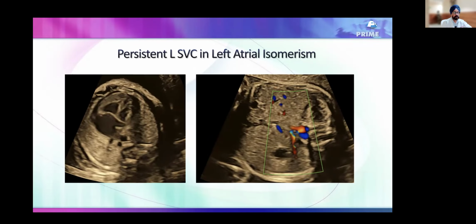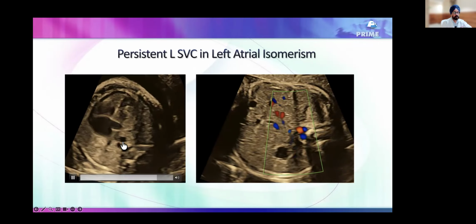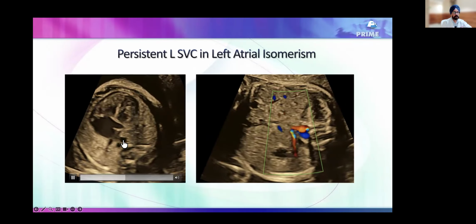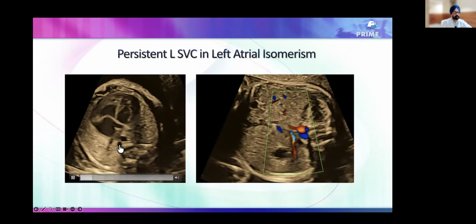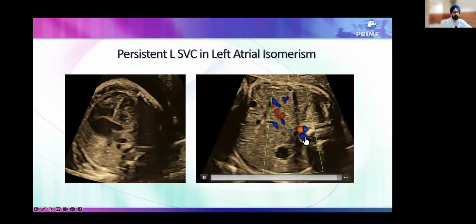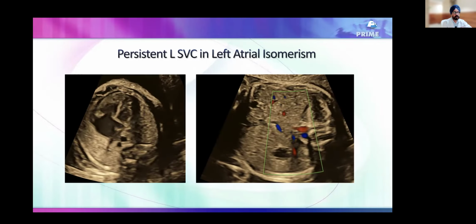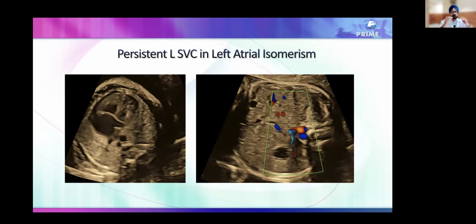And in this patient, you see this is the descending aorta, and this is another vessel there. Why do I say this is the descending aorta? This is pulsatile. The other vessel is a vein. It's not as pulsatile. Then in an abdominal view, you see the vein lying just close to the aorta, and that means the IVC cannot lie posteriorly.